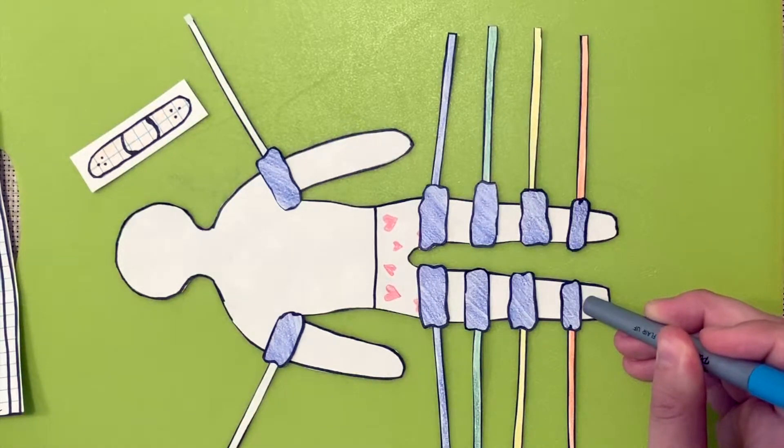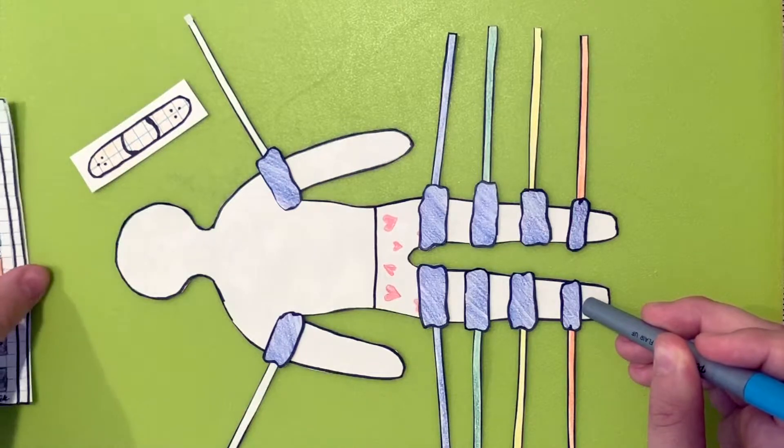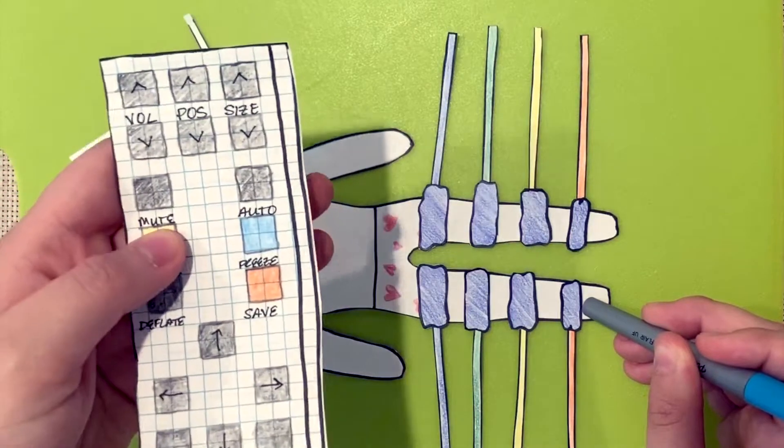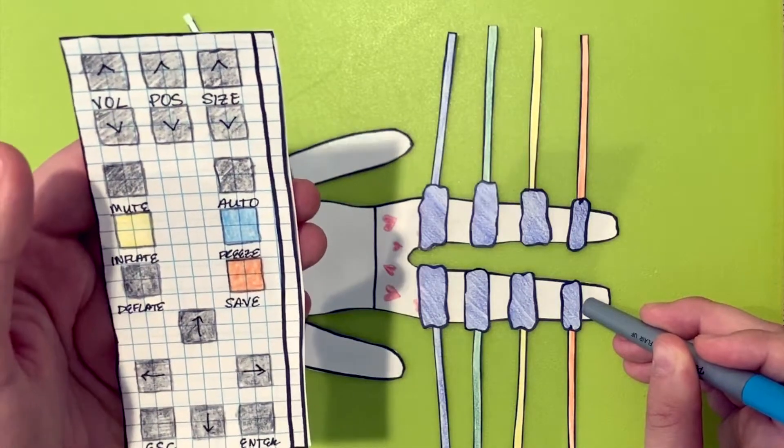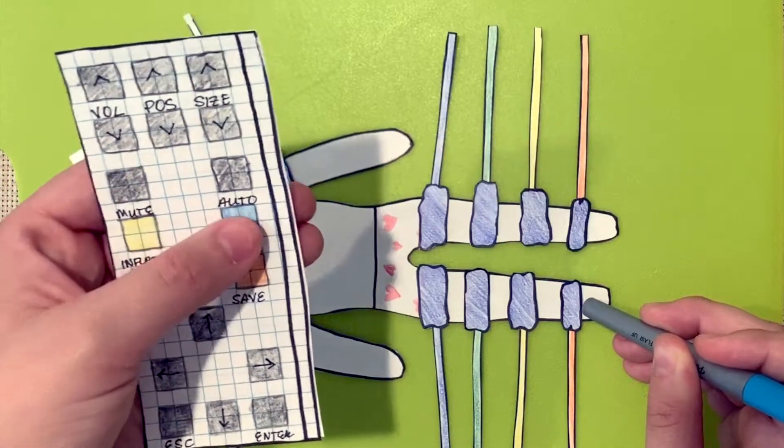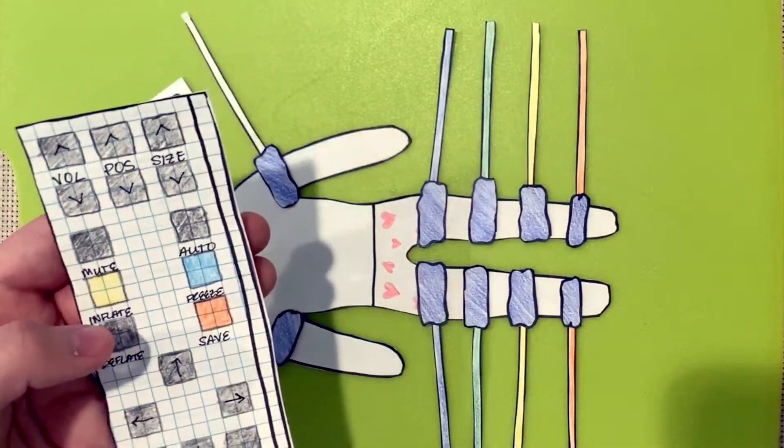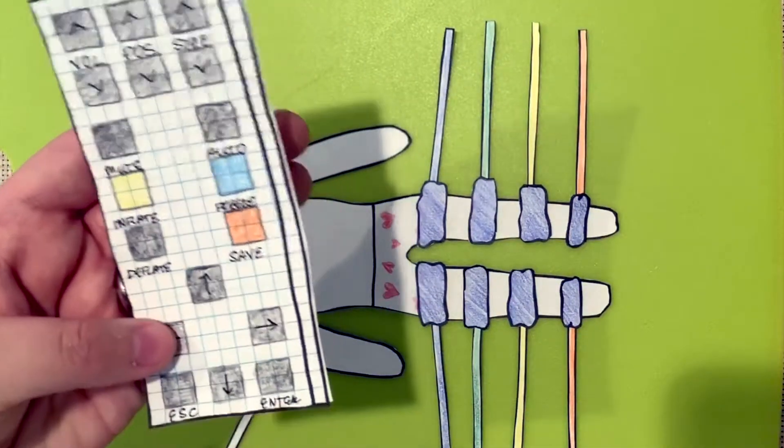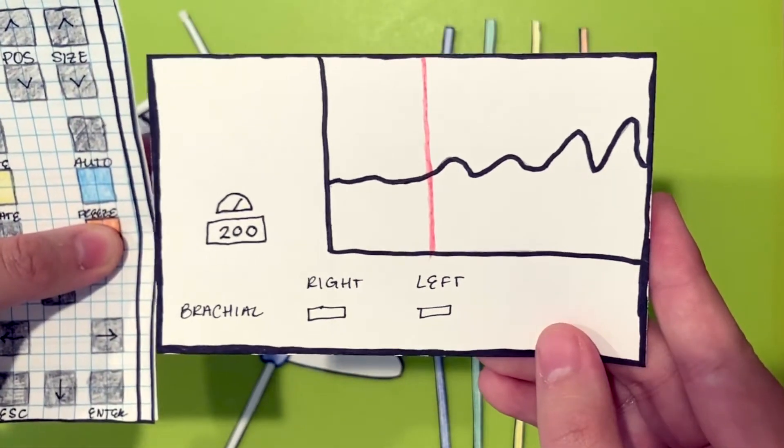After locating a strong signal, you will use the remote to inflate the cuff. Hold the inflate button until the signal is gone and then release. The cuff will bleed back on its own until the signal returns. Freeze the frame and quickly deflate the cuff. You will then scroll back to the first pulse and acquire the pressures with the save button on the remote.